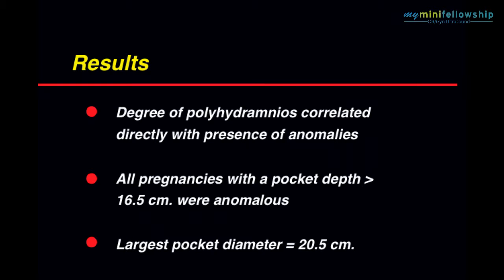The largest pocket diameter in this study was 20.5 centimeters. That is a whopping amount of polyhydramnios. My current personal gold medalist is 22 centimeters. And all I can tell you is that when you see a woman with a 22 centimeter deepest vertical pocket, your heart goes out, because it's an extremely uncomfortable thing for her to experience.